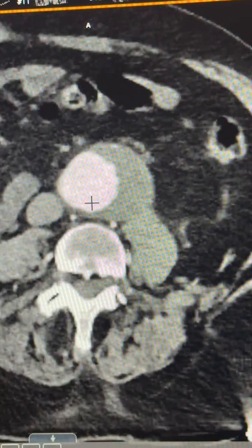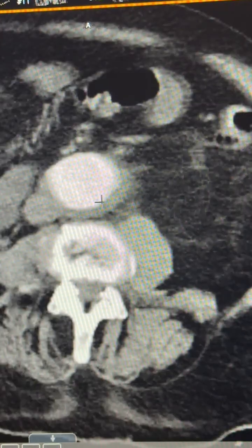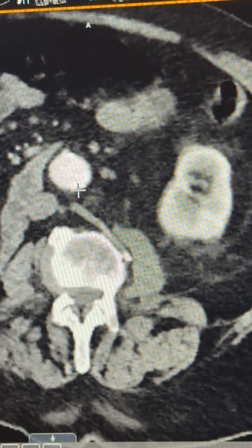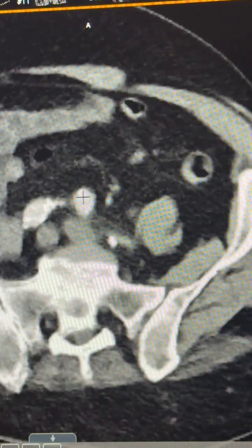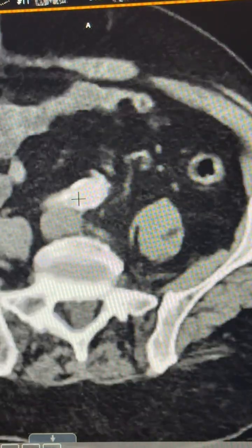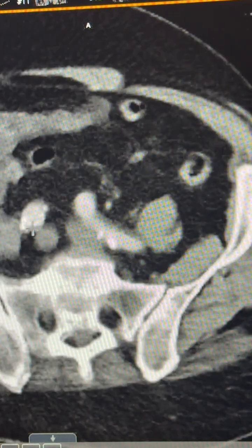And if you look at this portion here, the aneurysm, you try to measure it from here to there. It's about 5 centimeters, and then it turns sideways. So the question is really, is this worthwhile to fix at this point? We're in a relatively rural area, so it's hard to fix him if we don't do it now. And we've been watching him.